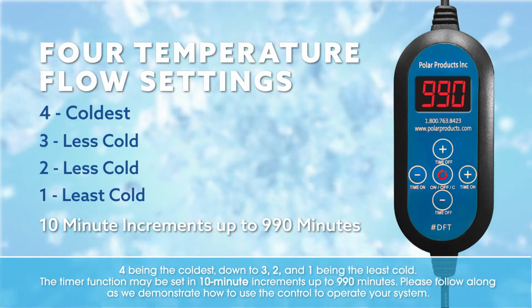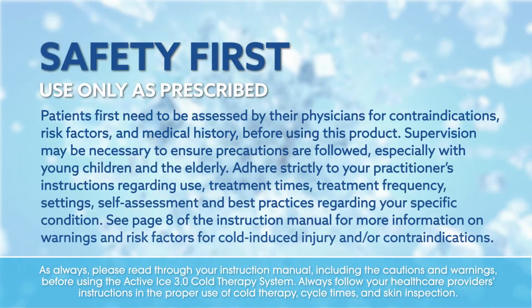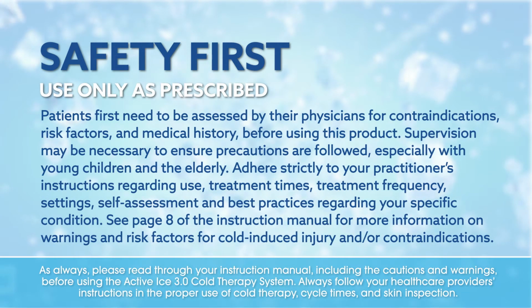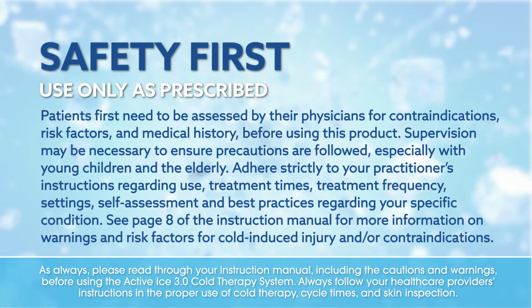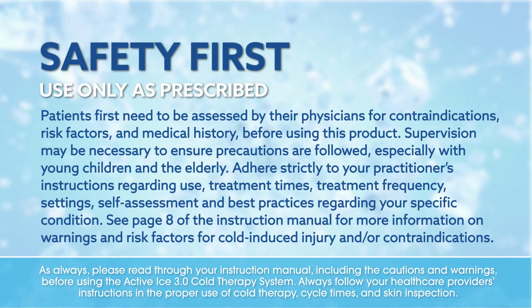Please follow along as we demonstrate how to use the control to operate your system. As always, please read through your instruction manual, including the cautions and warnings, before using the Active Ice 3.0 Cold Therapy System. Always follow your healthcare provider's instructions in the proper use of cold therapy, cycle times, and skin inspection.